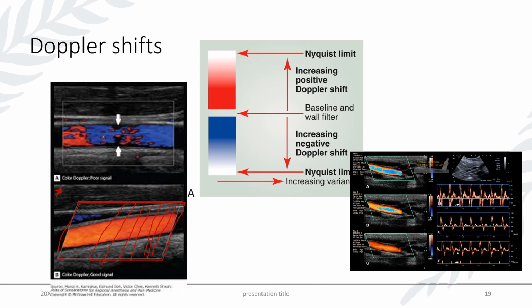Now, as the operator, you or anybody else operating this equipment could shift or steer the box the other direction. Now, when I have motion that is coming toward the scan lines, here you see they're going to intersect because they're moving toward one another. This would give me a positive Doppler shift.